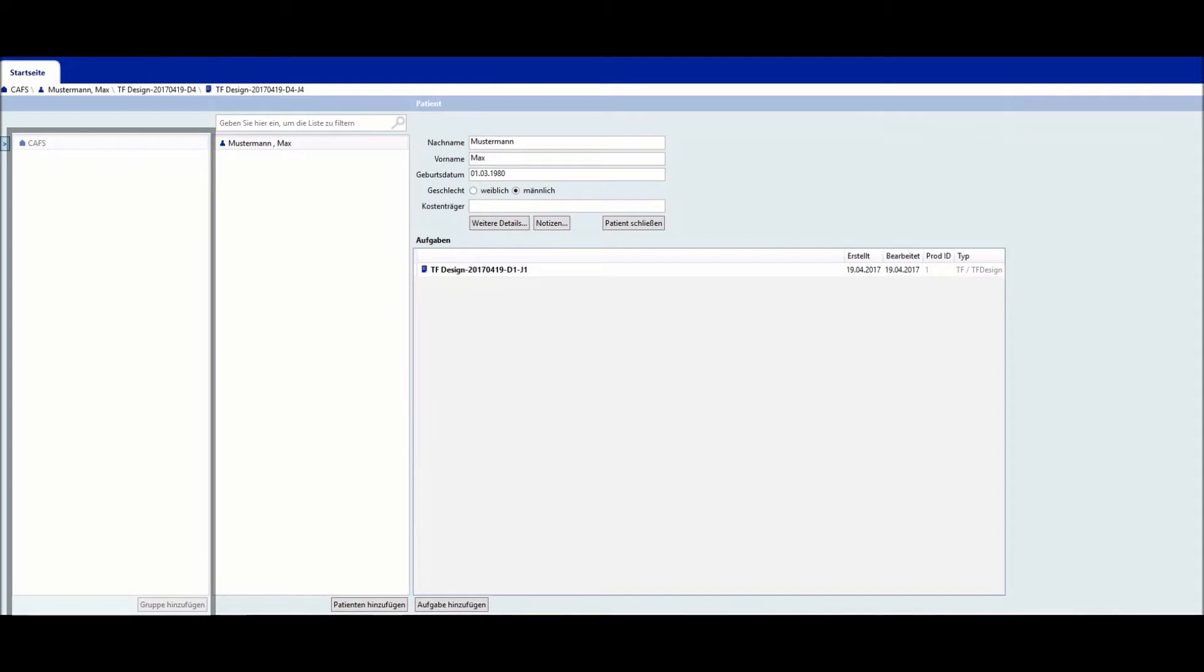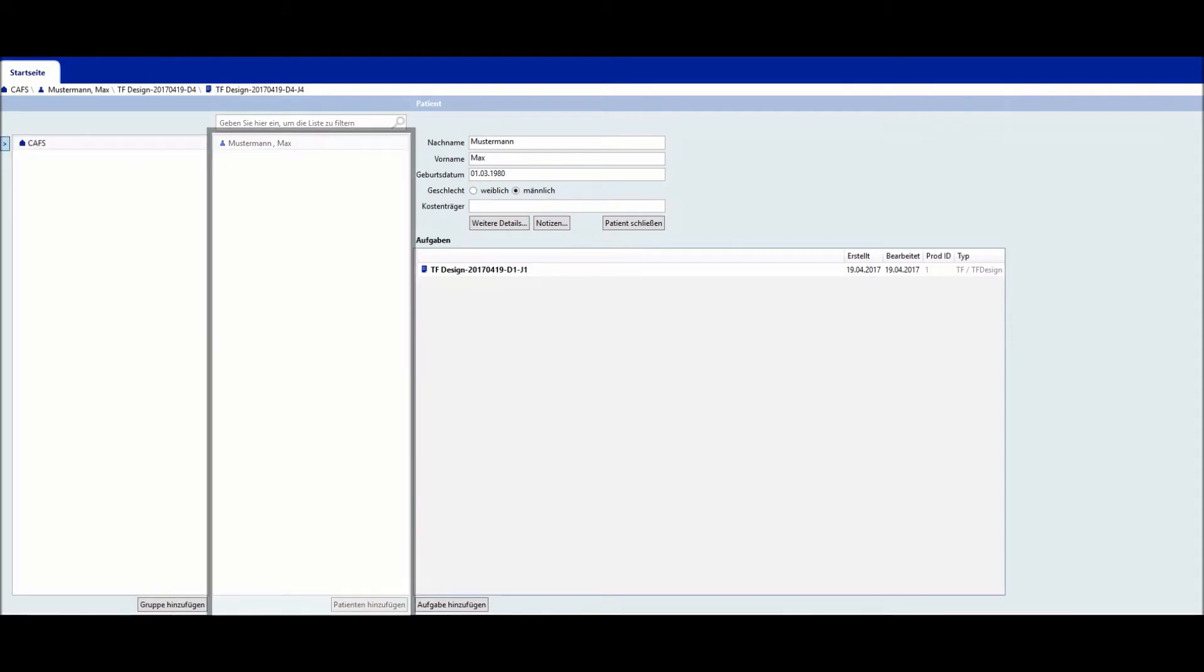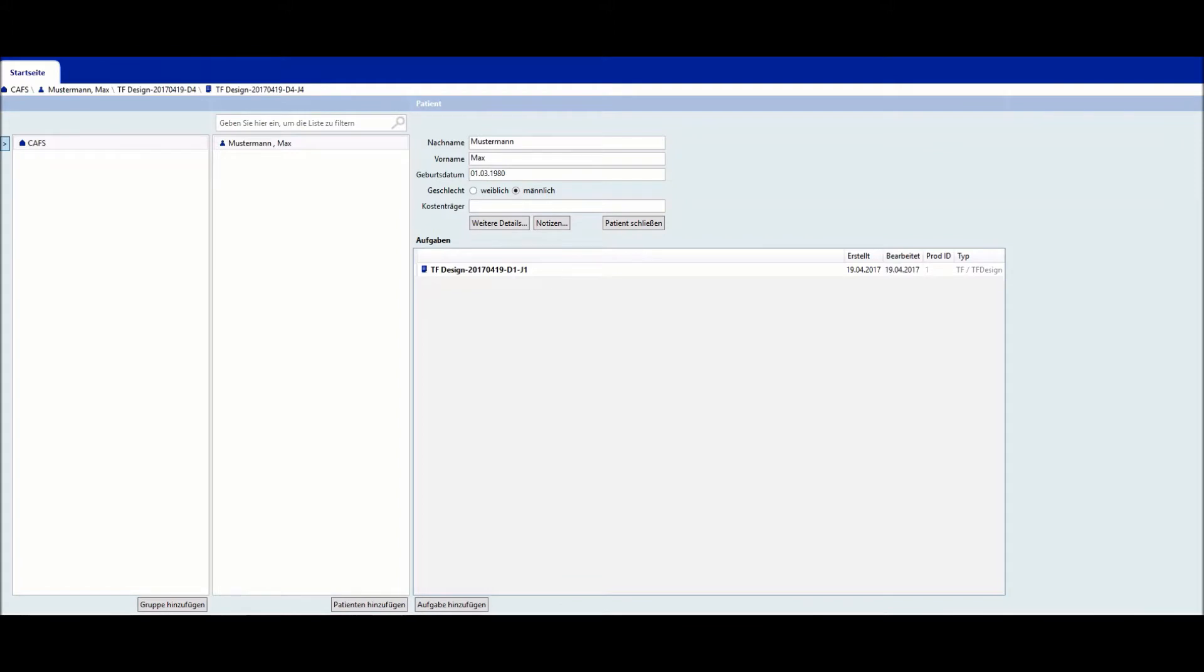Various groups can be created in the left-hand field. In the center field, existing patients can be selected or a new patient can be created. This is done by entering all of the relevant data in the provided fields.